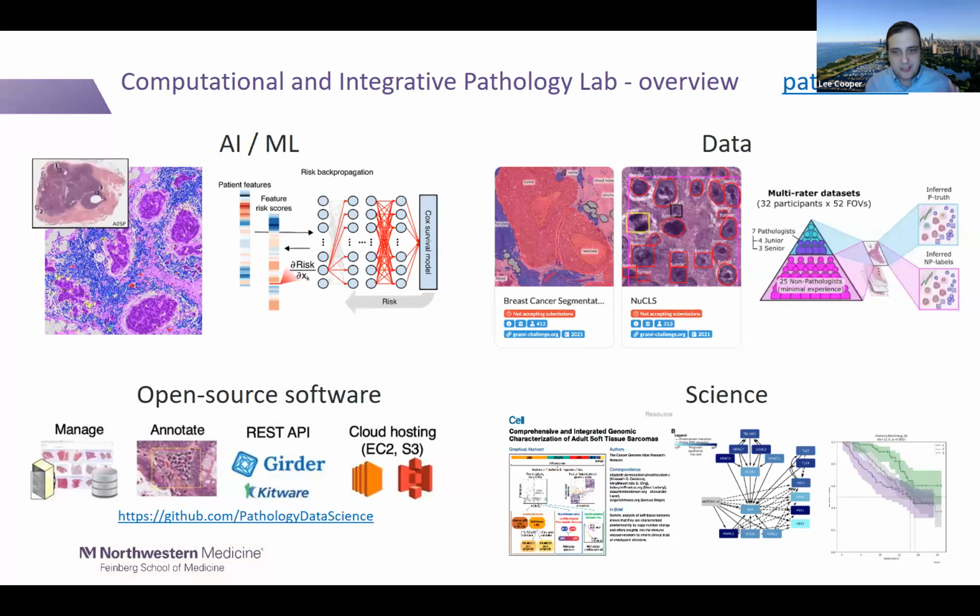So I think of our research as having 4 components or pillars. And really the core component is the AI and the machine learning. So it's computer vision, developing new algorithms to make predictions or to do fundamental tasks like detection, classification, and segmentation in large images. We also work a lot with omics data because that also comes from the pathology lab. So some of this is very fundamental machine learning research. It's not just applied to histology data, but to other images as well.